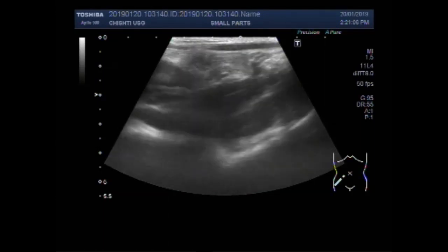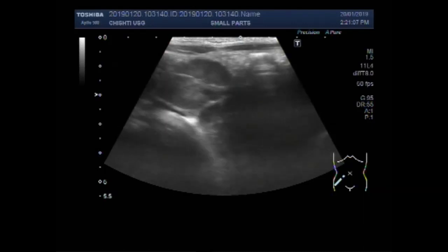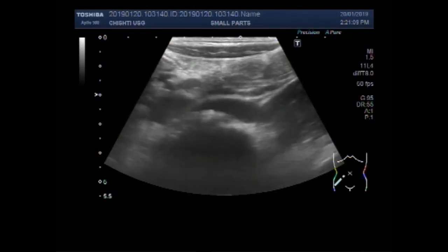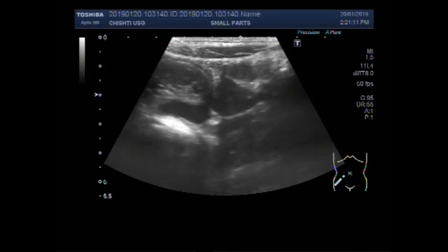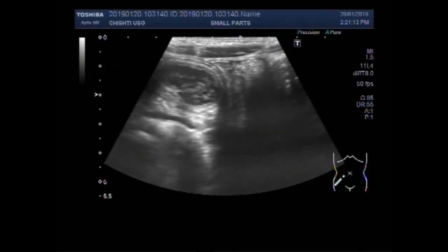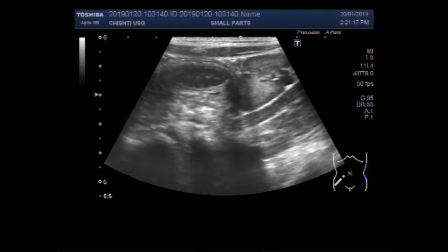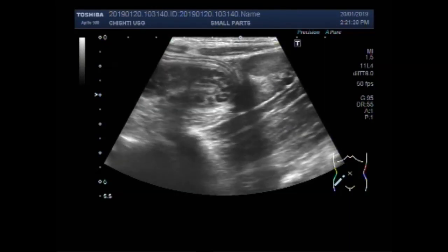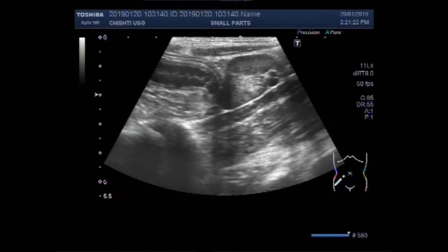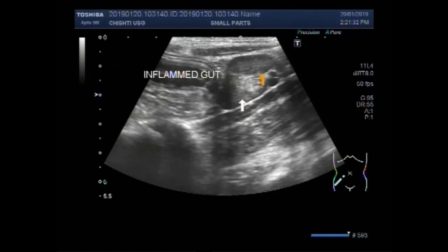Now you can see a number of enlarged mesenteric lymph nodes lying just adjacent to the inflamed gut loop in the right iliac fossa. This is the inflamed gut loop and these are the enlarged lymph nodes.